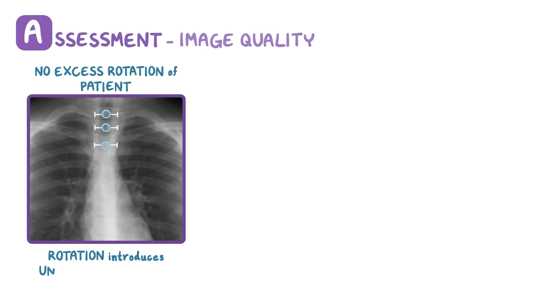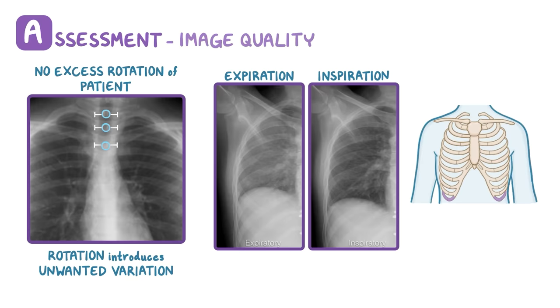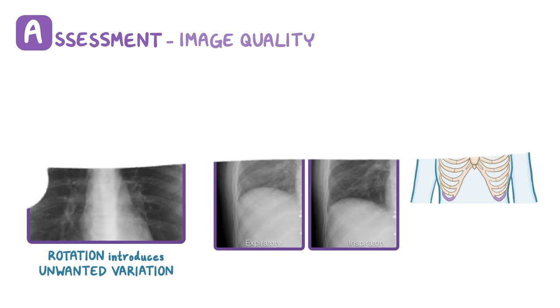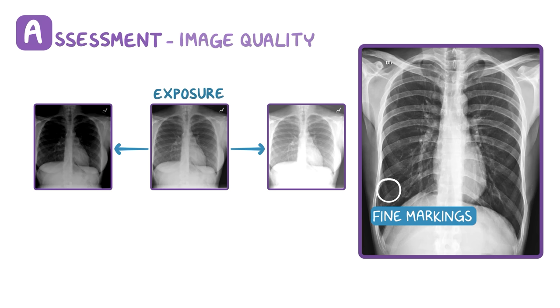Next, a good inspiration film should show at least the 10th or 11th posterior ribs. If the lungs are not fully expanded, we might miss important diseases. Finally, we need to make sure that the exposure isn't too bright or too dark. To check for this, you can look for fine markings in the lung fields to make sure they're visible. If the fine lung markings aren't visible, then the x-ray may fail to detect some diseases.